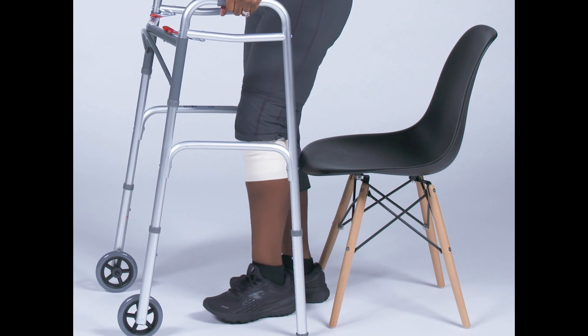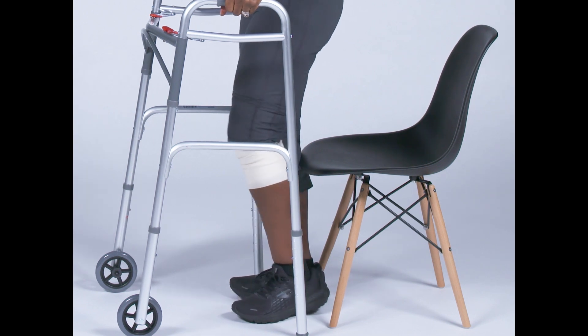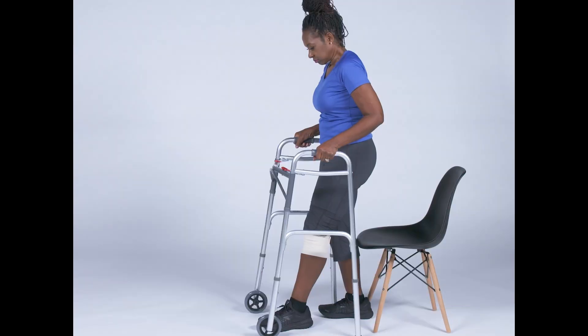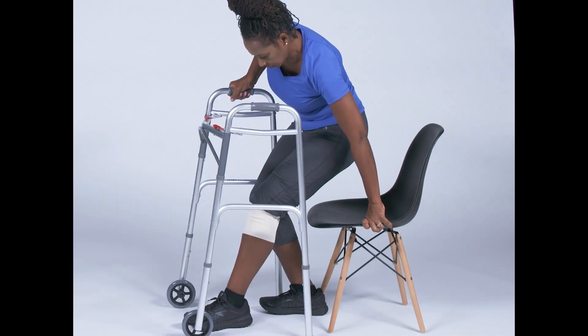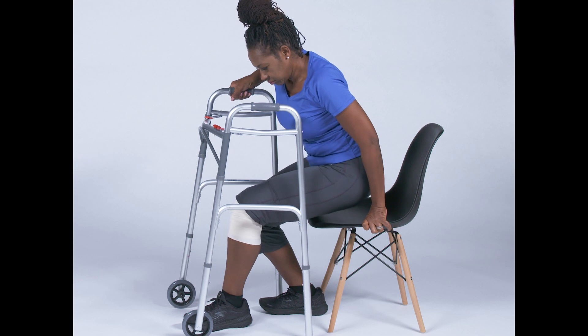Instead, back up until you feel the chair behind your legs. Slide your surgical leg slightly out in front of you to protect it. Leave one hand on the walker for stability and use the other hand to reach back for the edge of the chair or the armrest. As soon as you find the chair with your hand, you can sit down slowly.